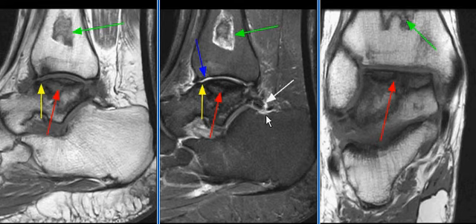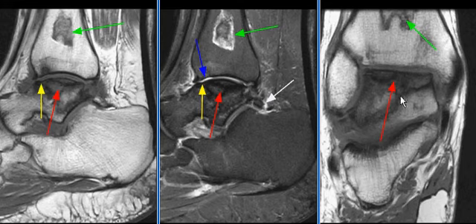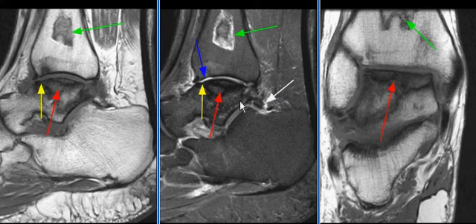There is synovitis adjacent to the os trigonum. An infarct is also seen in the distal tibia. The MRI findings are consistent with avascular necrosis of the talar dome.